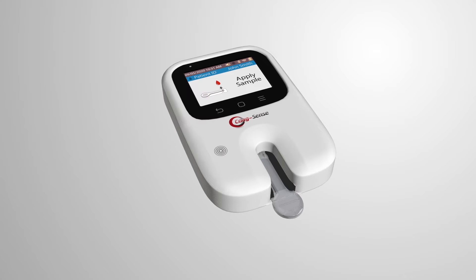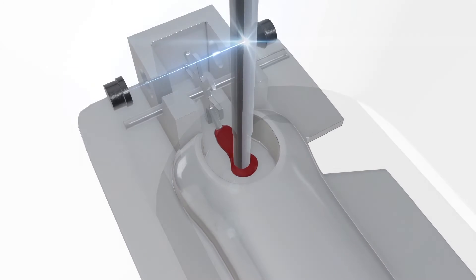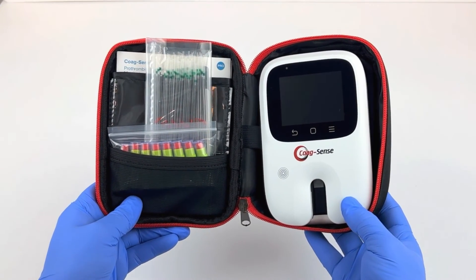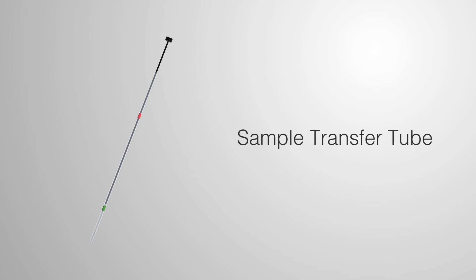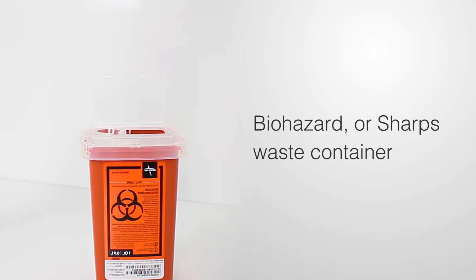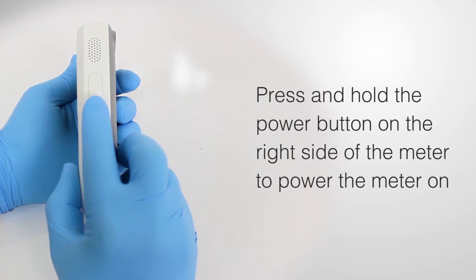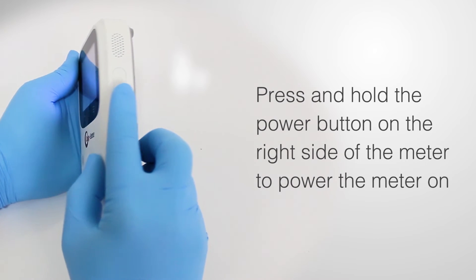This video provides a brief overview of how to perform a PT-INR test. Make sure that you have all the supplies needed before you start, including a 21-gauge lancet, sample transfer tubes, sterile alcohol prep pads, gauze square, and a biohazard or sharps waste container. To begin, press and hold the power button on the right side of the meter to power the meter on.